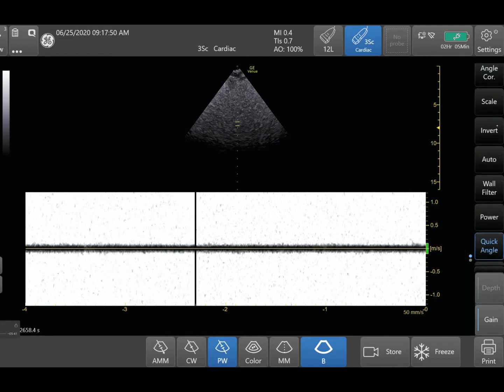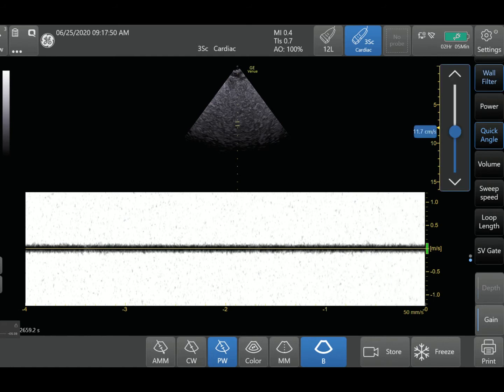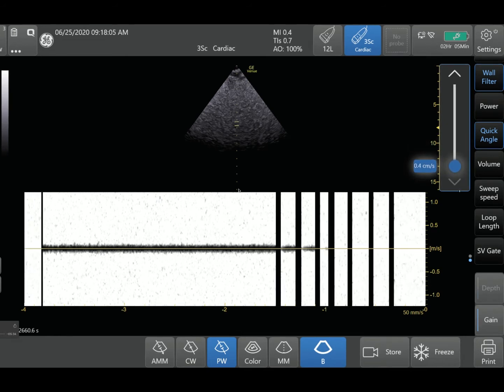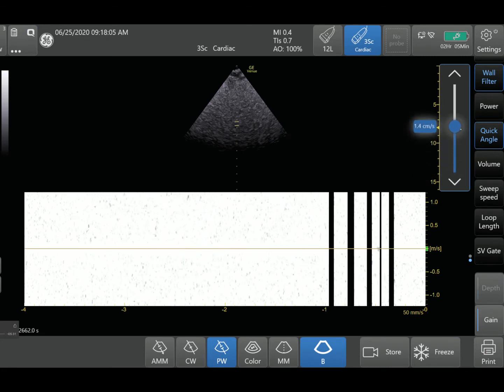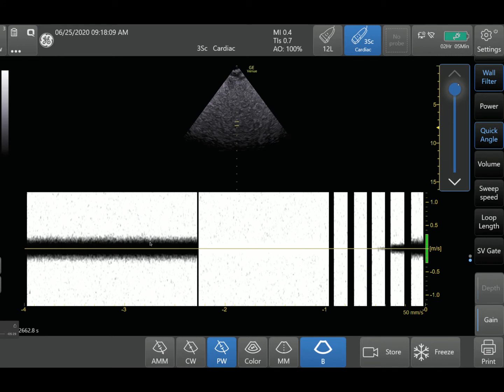I'm scrolling to see the wall filter function and activating it. When I bring it all the way down, it's at 0.4 centimeters per second — so it's not showing you anything that is 0.4 centimeters per second or lower, meaning it's going to show you essentially everything because 0.4 centimeters per second is really low velocity. Conversely, if I increase the wall filter all the way up to almost 30 centimeters per second, it's not going to show me any signals that are 30 centimeters per second or less, so that area will appear all dark.